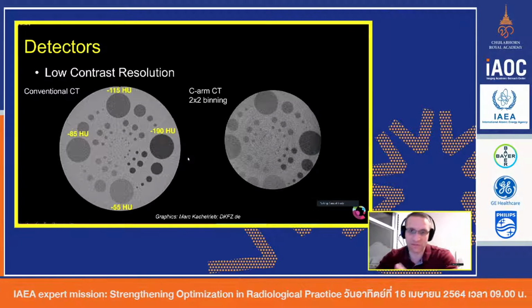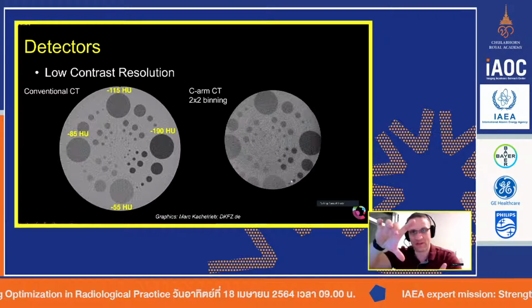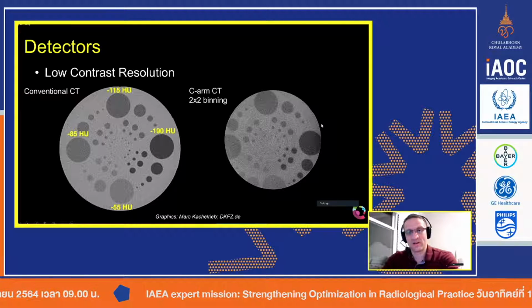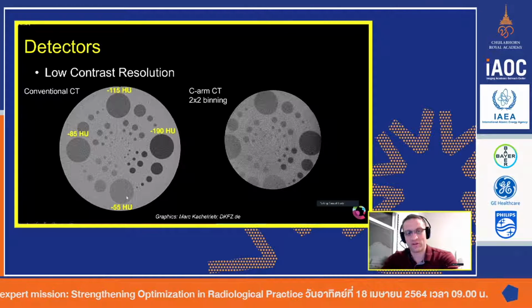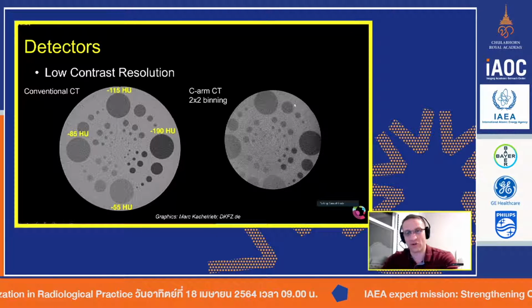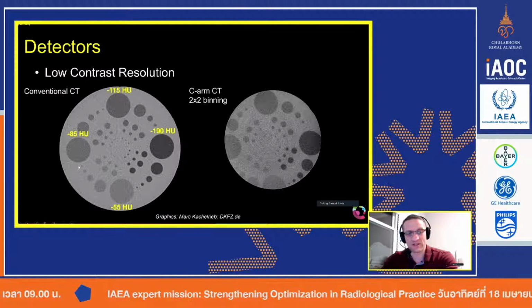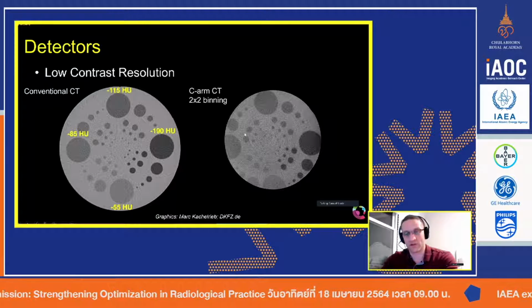Where they are limited, as we talked about with the CT, is the field of view, since you just have a specific detector. The detectors will have a lot more artifacts because they don't do a full 360 rotation. That's why you see this ringing. And the true contrast differentiation is a little lower. It's still comparable, I would argue, but maybe a little lower. You might not be able to see these two features right here, but you can distinctly see them on a regular CT scanner. Part of that is, of course, the lower quality, lower dose, and the noising effect.